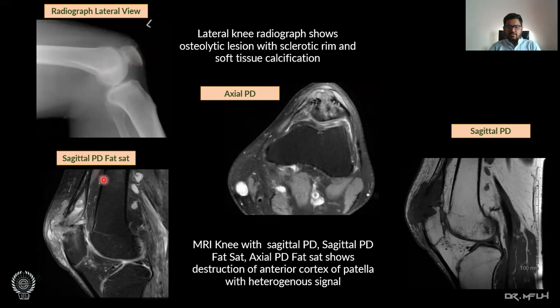On axial proton density fat-sat, axial proton density, and sagittal proton density knee images, there is destruction of the anterior cortex of the patella with heterogeneous signal intensity.